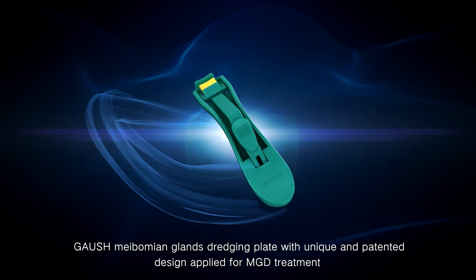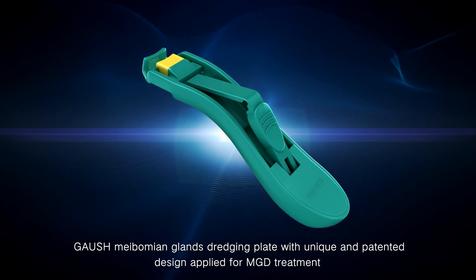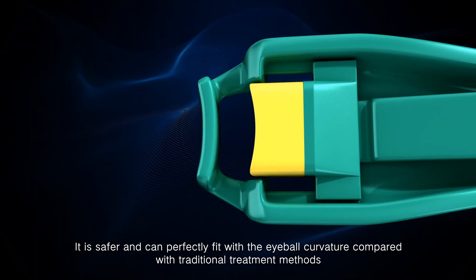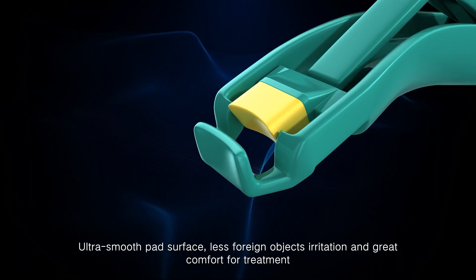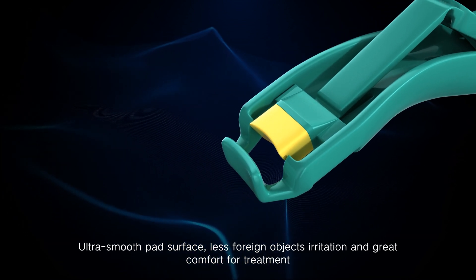The Meibomian gland dredging plate, with its unique and patented design, is applied for MGD treatment. It is safer and can perfectly fit the eyeball curvature compared with traditional treatment methods. The ultra-smooth pad surface prevents foreign object irritation and provides great comfort during treatment.